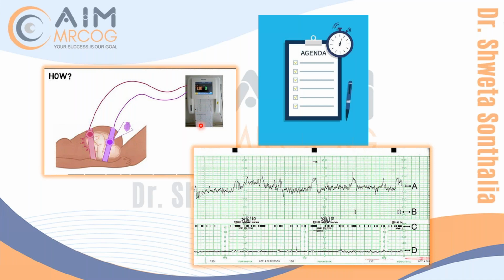CTG is basically a monitoring of the fetal heart, and it tells about fetal well-being as well as sometimes maternal well-being. So both ways it is important, and it is very important to have CTG in high-risk women. You don't do CTG for everyone, that's the fact. Low-risk women who deliver in a birth center, either alongside or far away, don't have a CTG facility, because a birth center has low-risk deliveries. But if anybody becomes high risk, like delay in progress, or they want an epidural, they have to be shifted to hospital, and then they need CTG monitoring.